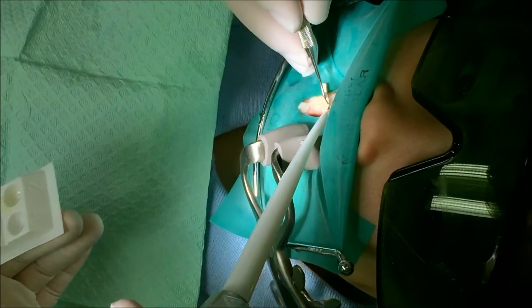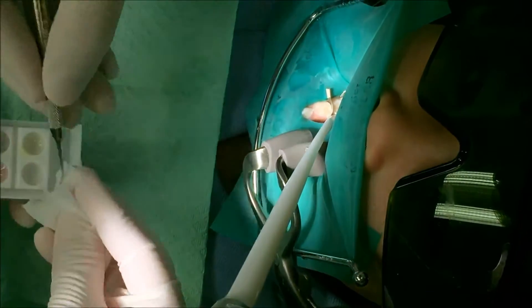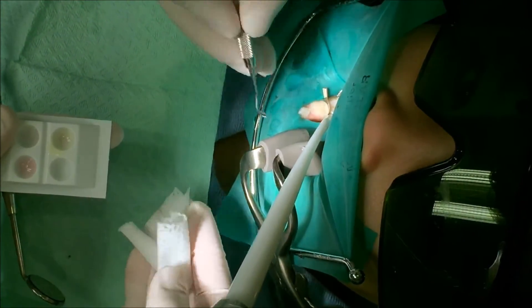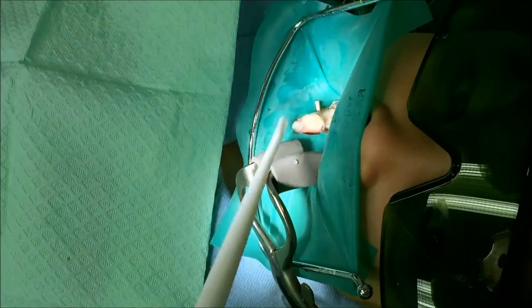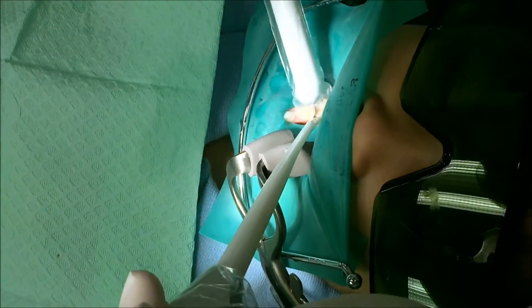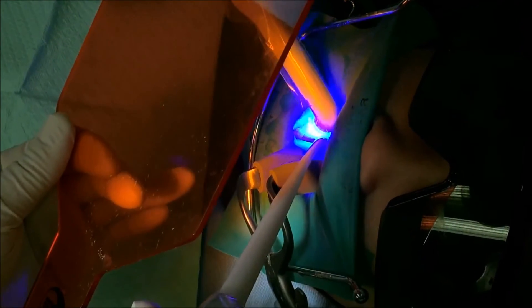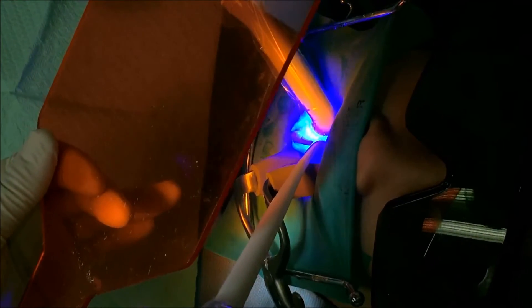I'm going to shine the light on the other two. I'll try to stick this on. We'll wait for a minute and then the filling will harden up and you can start eating right away, because we didn't have to numb up your tooth. It's just your gum that is a little bit numb. Good job — that was 20 seconds.